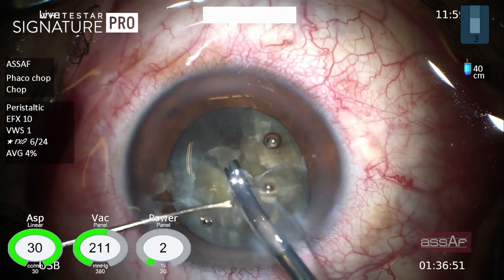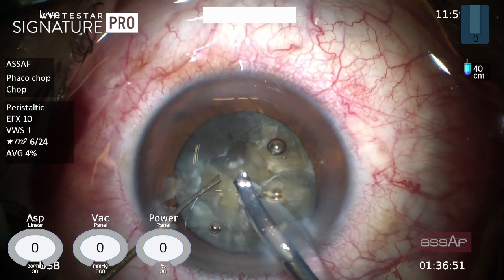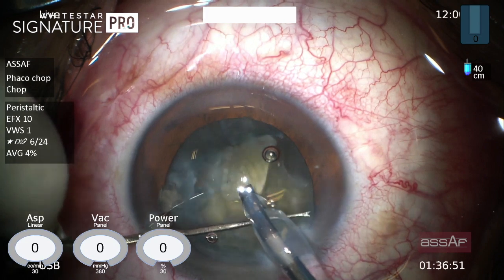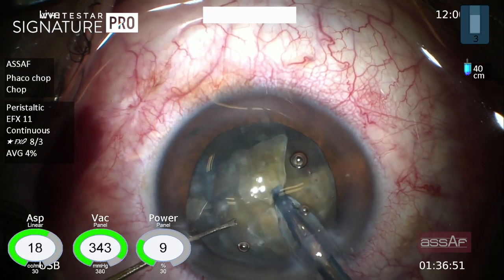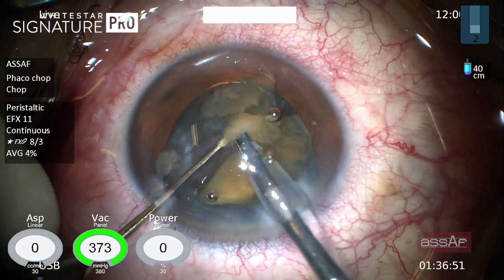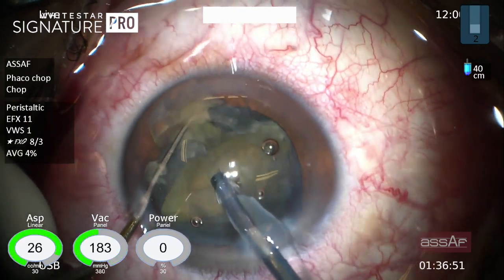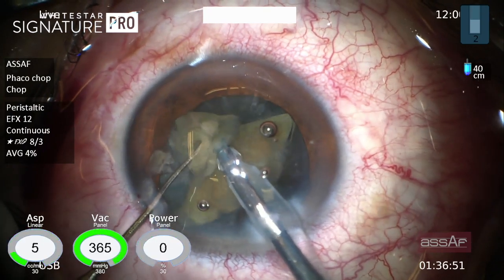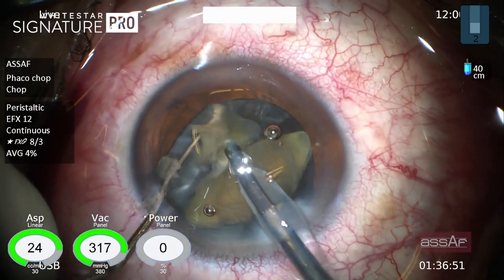In post-vitrectomy eyes the posterior capsule tends to trampoline excessively towards the phaco tip because of the lax zonules. We can reduce the vacuum in these settings to improve stability; however, reduction of the vacuum may cause loss of holdability of the nuclear fragments against the phaco tip.